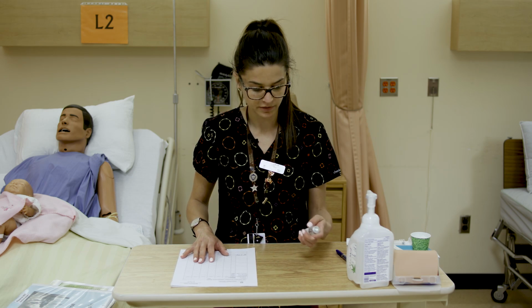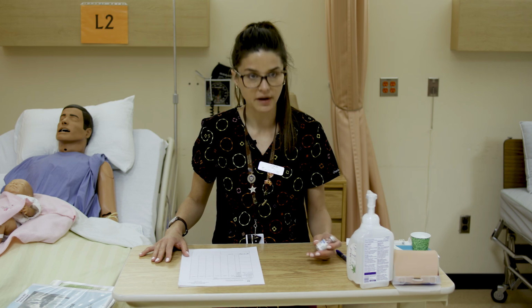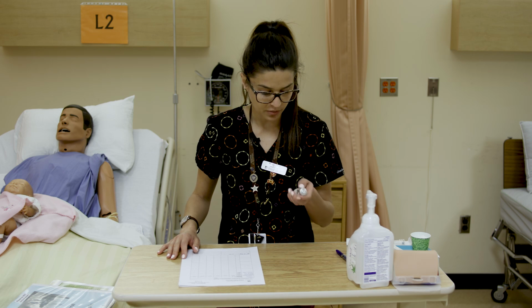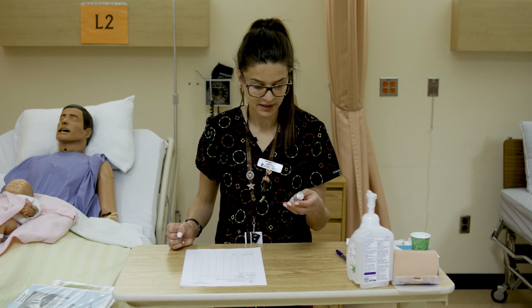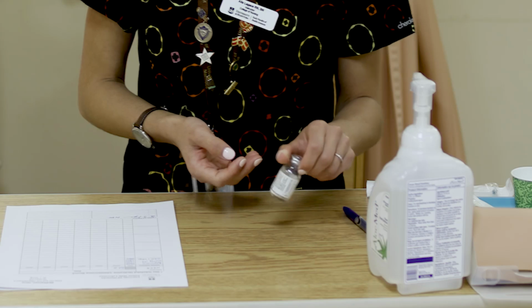And part 2 of the first check is making sure that we do in fact have the correct medication and it matches our MAR and that it's reasonable that we can get that dose from this vial. So we have taken from the patient's drawer the ampicillin vial, and it's in a powder form right now. So we'll also be reviewing how to reconstitute a medication.